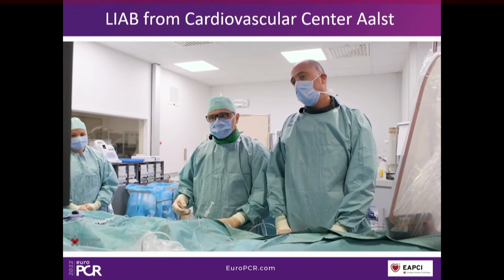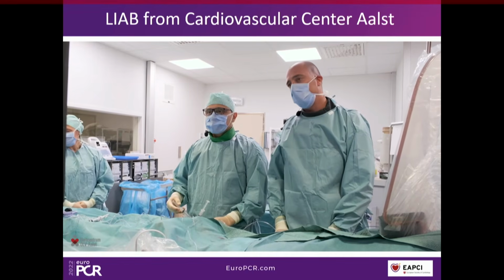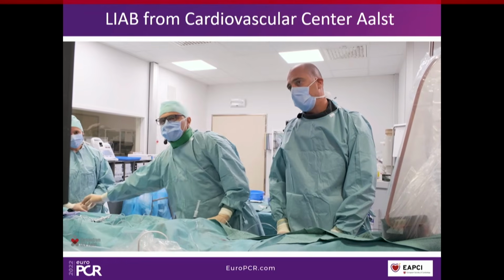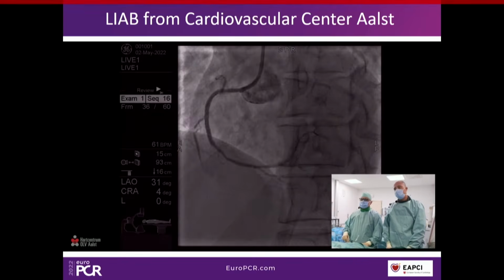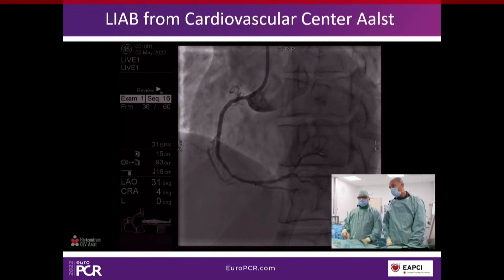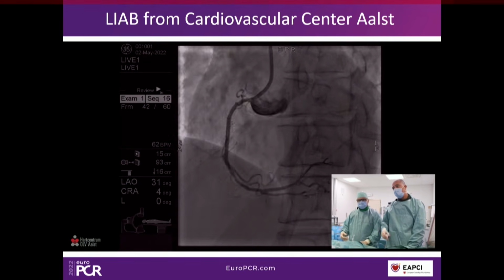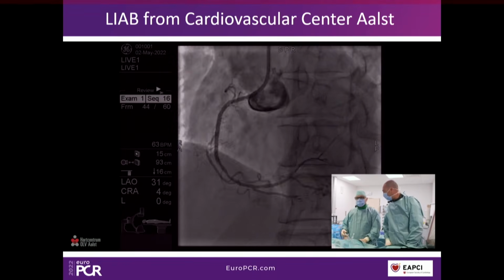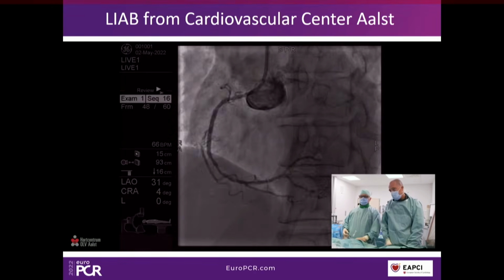So we have implanted a 2.75/28 stent, and we have seen that there's some residual disease in the right coronary artery. So what we're going to apply now is the PIOS principle, where we will measure the FFR, perform a pullback, and look for residual gradients outside the stent. That could be the target for an extra stent, of course, or a residual gradient within the stent, where you can end the procedure with a stent optimization, of course, to achieve the highest possible FFR.